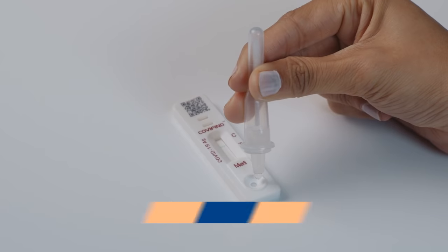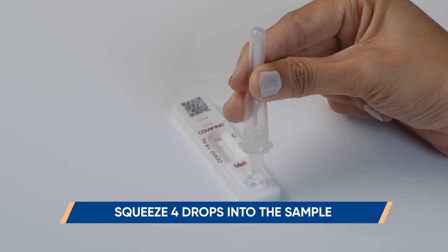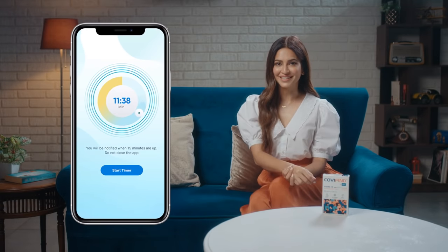Step 3: Drop. Squeeze 4 drops of the fluid into the sample well of the test device. Open the Covifine app and start the 15-minute timer. Now you wait. You can read the result at 15 minutes.